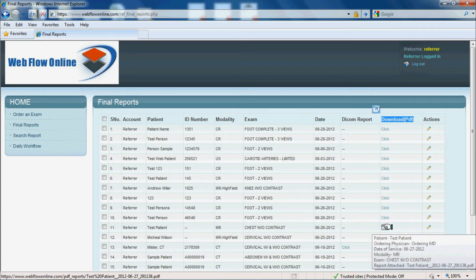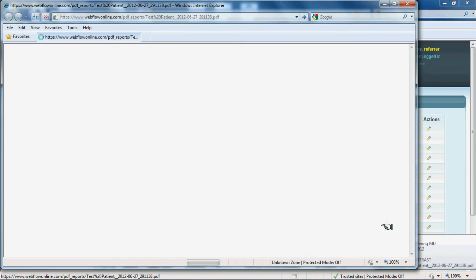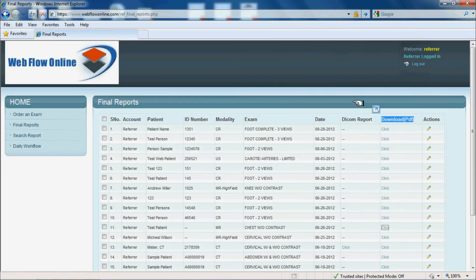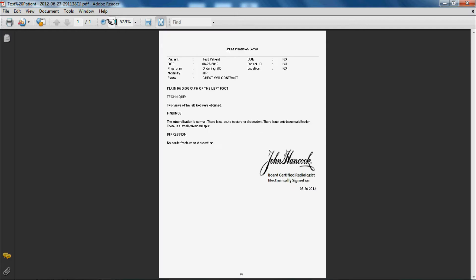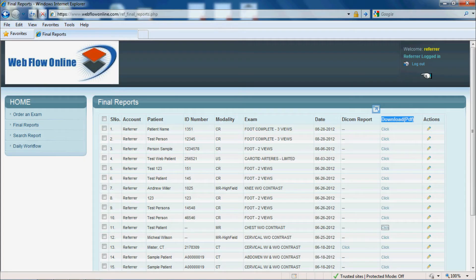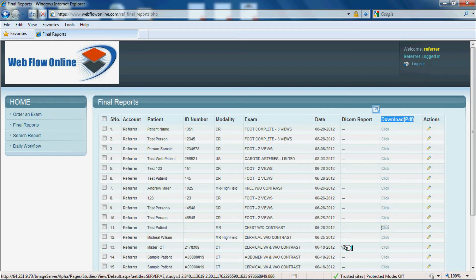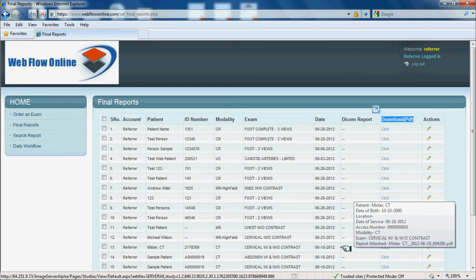If they click on any one of these links, they will get the final PDF report. They can print it, save it, and if they checked off multiple boxes, they can download multiples.